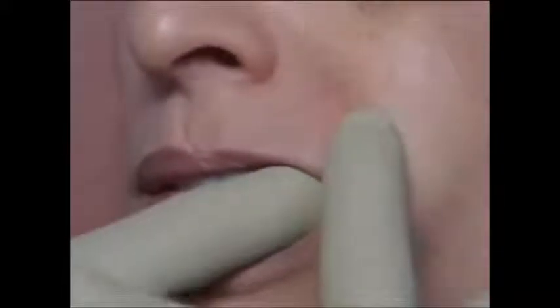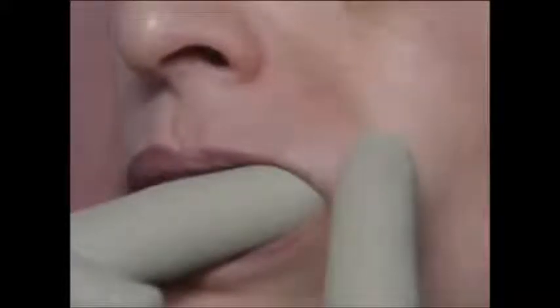After injection, bimanual palpation from inside and outside of the mouth can help determine if there are any irregularities or areas which require additional injection. In this case, it's very smooth.